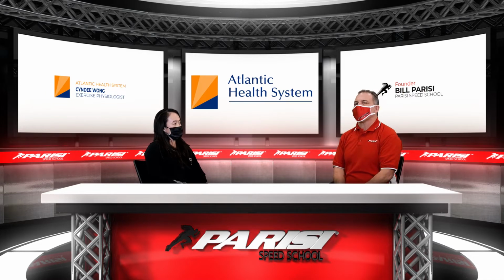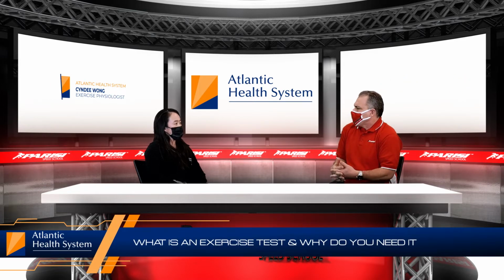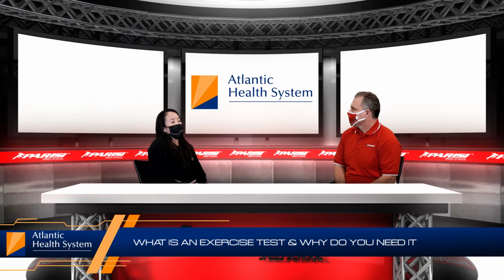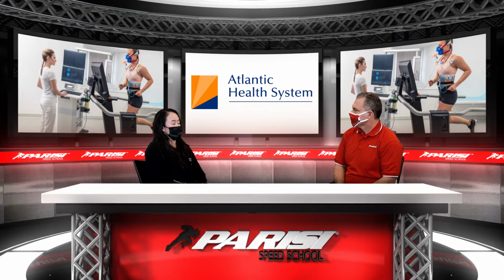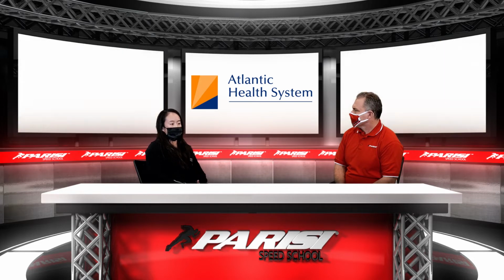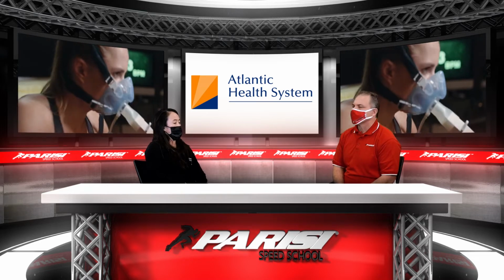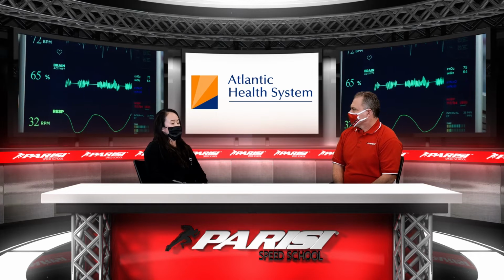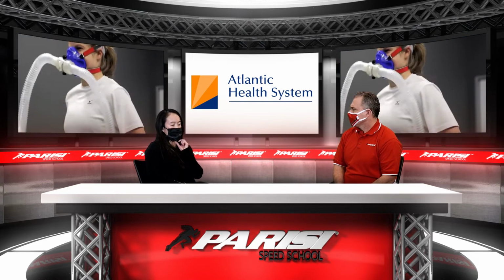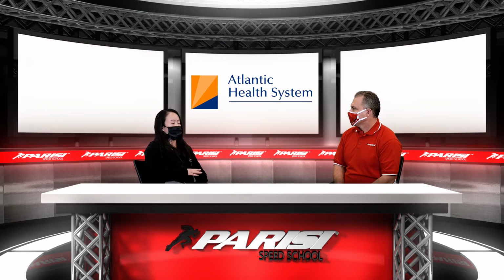Cyndee's going to talk to us about the importance of an exercise test for athletes and why it is helpful. So, an exercise test is a test that's typically done on a treadmill. It usually lasts about 8 to 12 minutes. An athlete is fitted with a spirometer, and essentially that's just a mask that goes over your nose and your mouth. It's hooked up to a machine that will measure the volume of oxygen your body is consuming. So we will set the athlete at a constant speed on the treadmill, and we'll gradually bring the incline up. And they're basically going to run until failure.